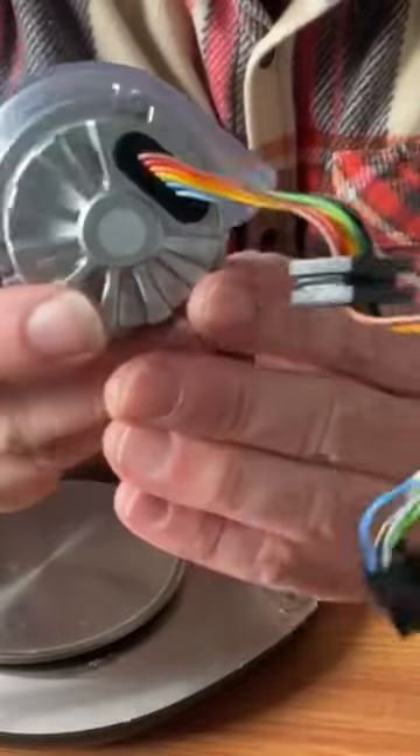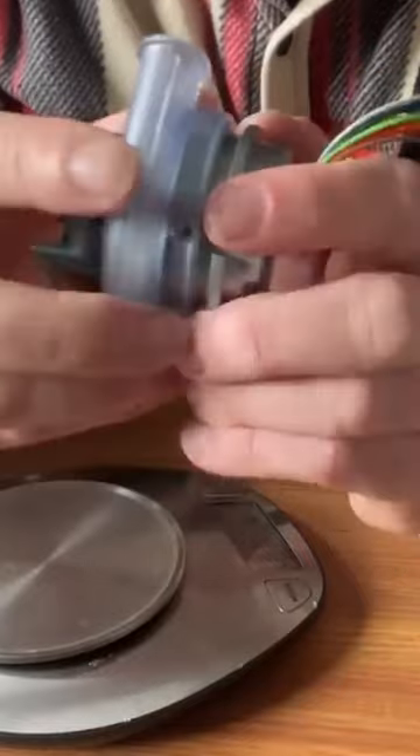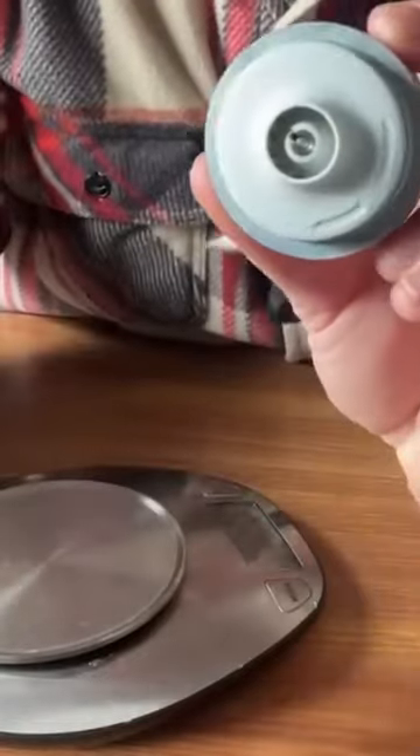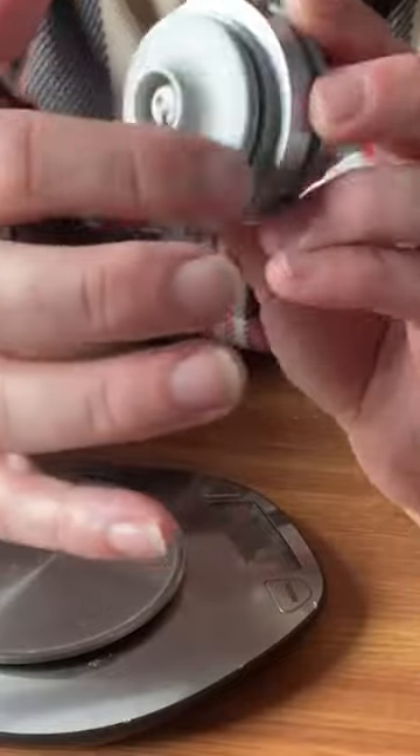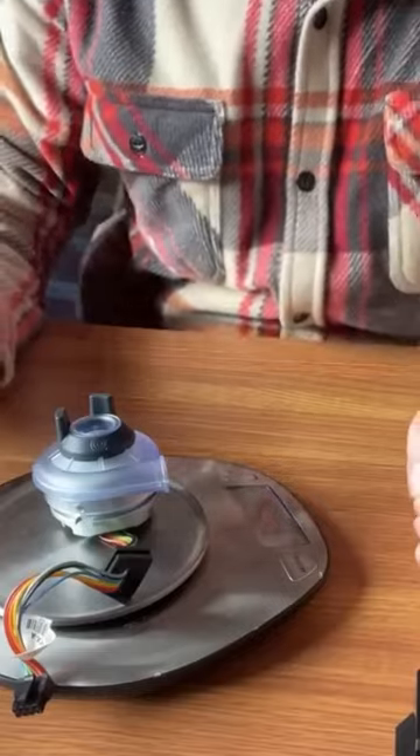This is in all her glory, your V8 Twin Turbo Micronel Blower. How cool is that? All right, let's see what she weighs — 230 grams, there you go.